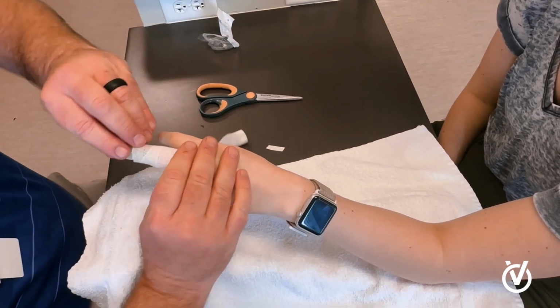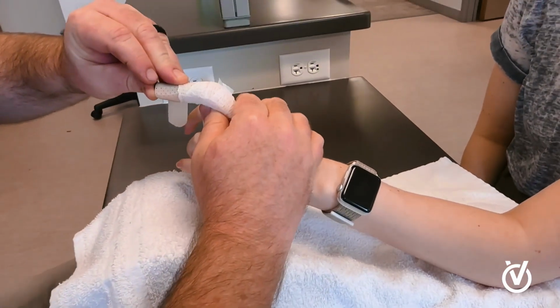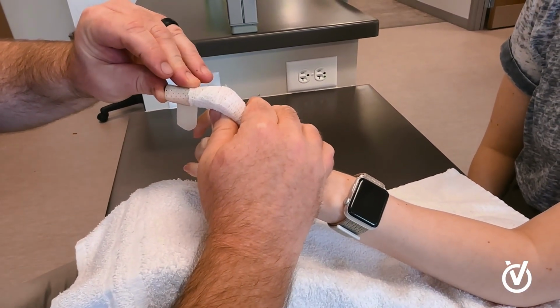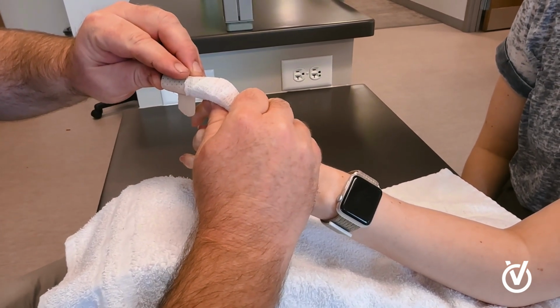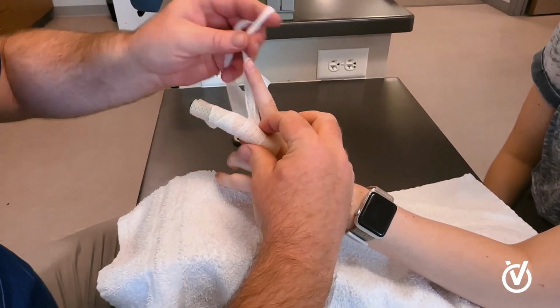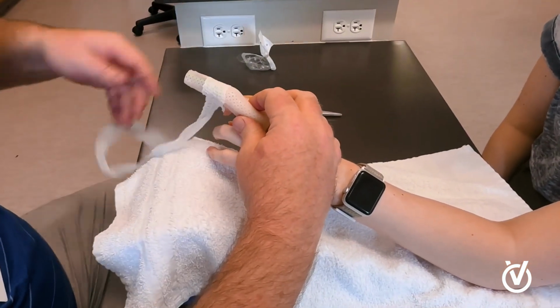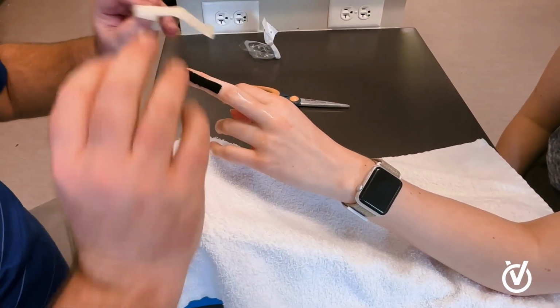This then frees up my hands to put her in the position of a boutonniere, basically, PIP flexion and DIP extension. And we're going to stay like this until it cools. Once it is cooled, I remove the wrap, remove the brace, and I finish it up.